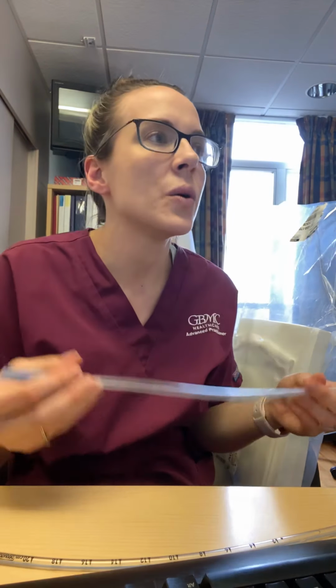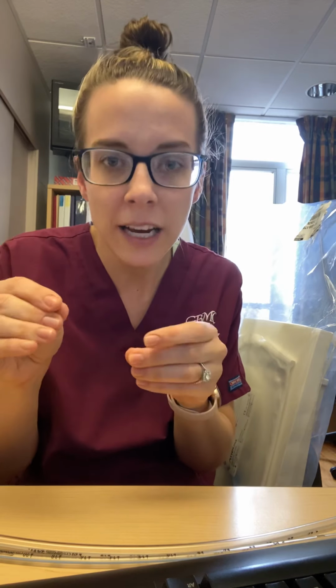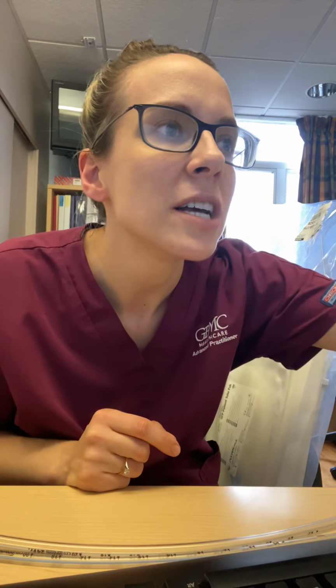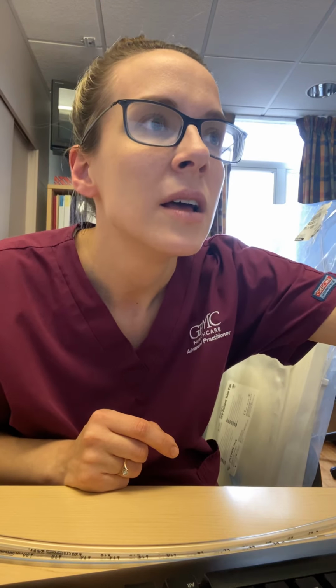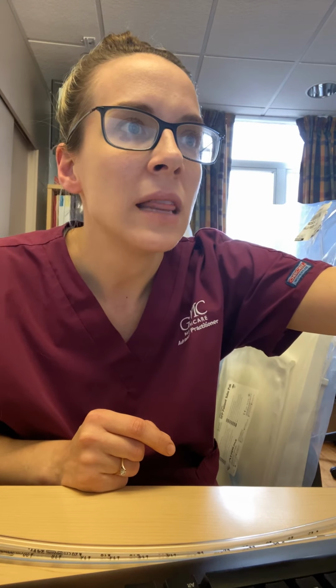So how does this whole concept of a chest tube work? So there's 3 chambers basically, and you can see in that schematic, all the way to the right is your collection chamber, in the middle is your water seal chamber, and all the way to the left is your suction control chamber. So if you see where it says chest tube on that schematic near the lung, the chest tube is coming out of the pleural cavity, following the length of the tubing into the Pleurovac, into the drainage box.